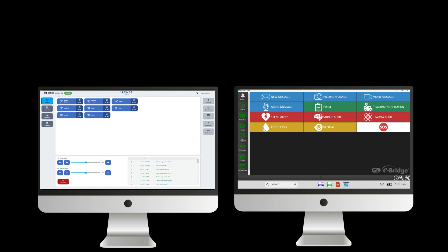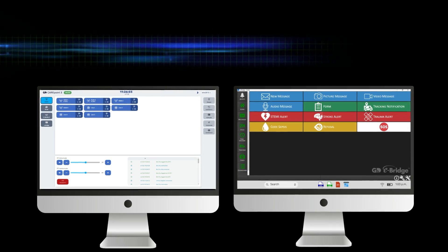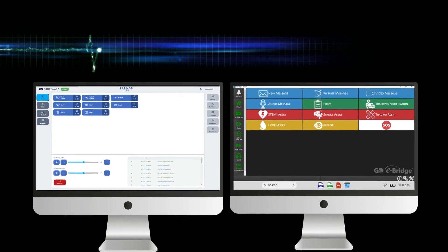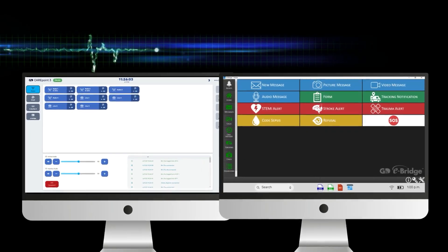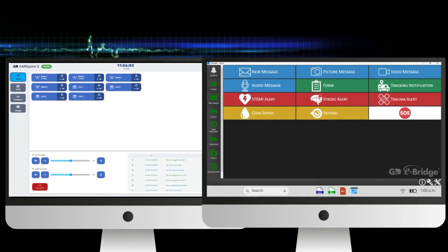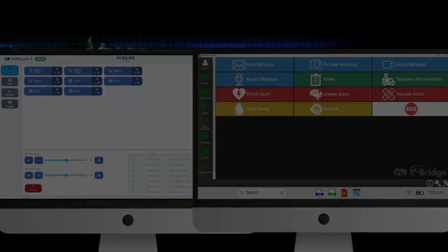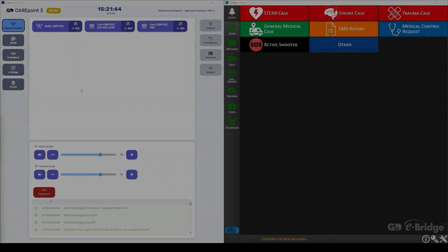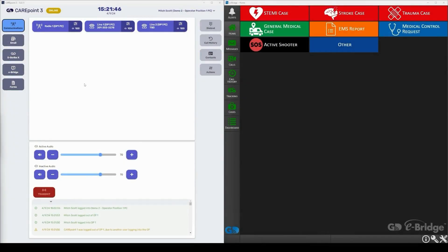To the left we have our CarePoint workstation, and to the right we have our eBridge communication platform. In this video, you will see how the two seamlessly connect to handle a 12 lead EKG transmission during a STEMI case.